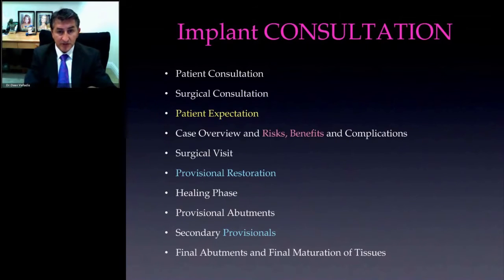For an implant consultation, I just want to list some highlights that we use. Patient expectation is one of the priorities to talk about with implants. They're not sure what they're getting. They've heard many different stories from the internet and their friends. So we like to clear all that up from the beginning.